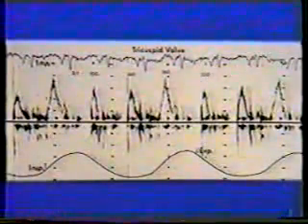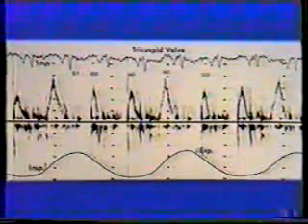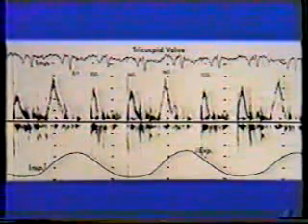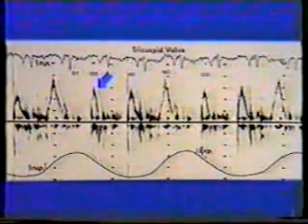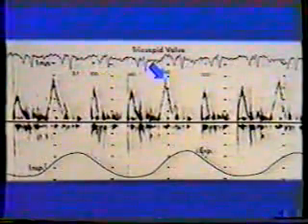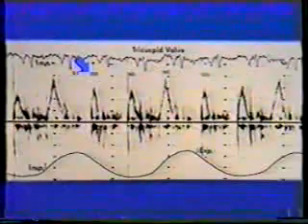We will now examine right-sided Doppler spectra for a patient with constrictive pericarditis before and after pericardiectomy. This recording was obtained with a sample volume between the tips of the tricuspid leaflets. The tricuspid E velocity is decreased for the first beat of expiration compared to inspiration. Furthermore, the tricuspid deceleration time falls from inspiration to expiration.